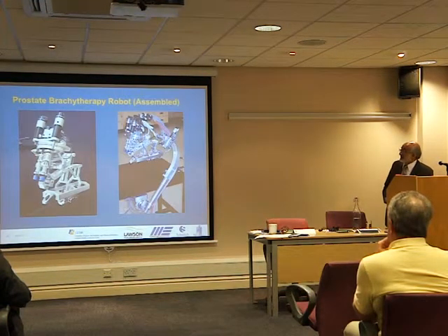This is the actual physical robot. So this was designed and assembled in the lab. And on this side here, we have another robot that is used to provide gross positioning of this. So this robot carries this prostate robot and positions it near the patient.